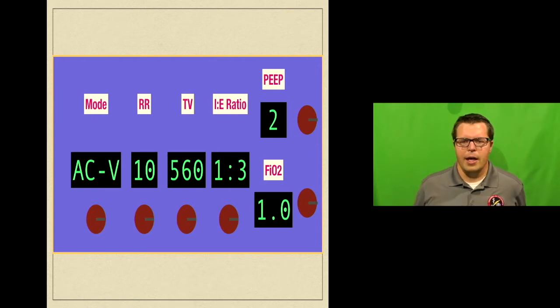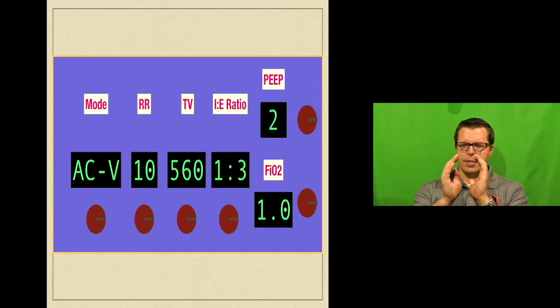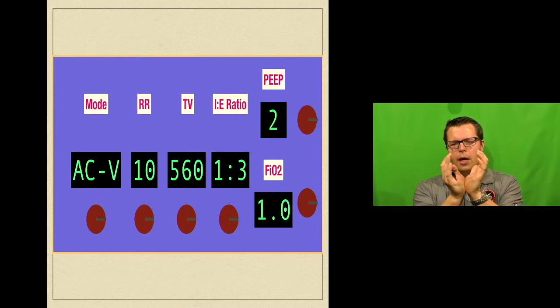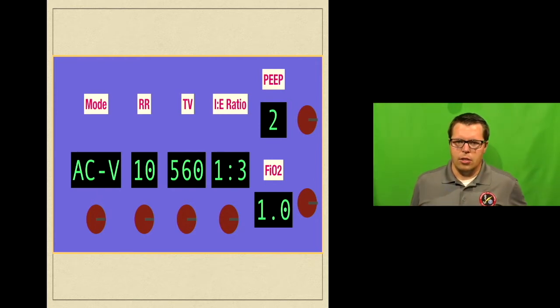The reason for that is that if you think about these guys, if you think about the thing that actually collapses, it tends to be the small airways themselves as they're leading out of the alveolus. And if you put a little bit of PEEP behind it, not a ton, but a little bit of PEEP behind it, instead of letting that thing collapse and get stuck together with mucus, if you splint it open a little bit, then you actually improve gas exchange through that thing.